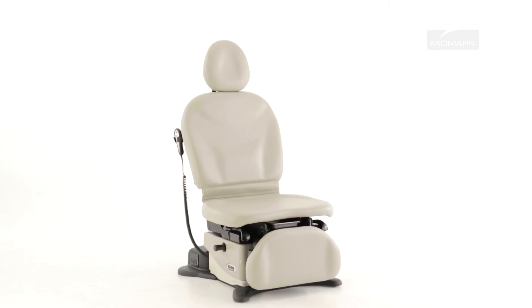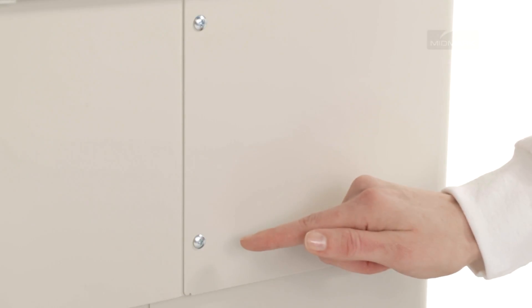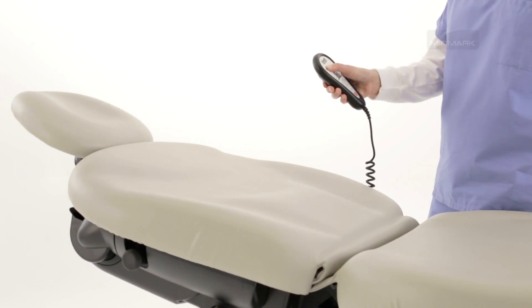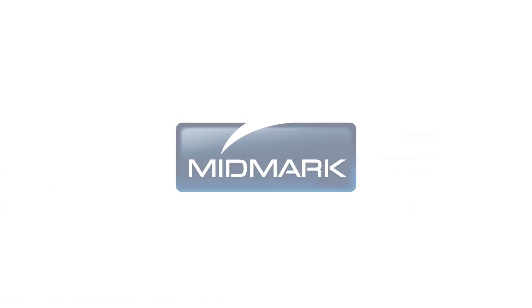Periodic inspection and adherence to the following guidelines will help to ensure proper operation of your table. Power cords should be free of cuts or other visible damage. All fasteners should be in place and tightened securely. All mechanical functions should operate properly. We recommend that you have an authorized service technician inspect your equipment every 6 months.